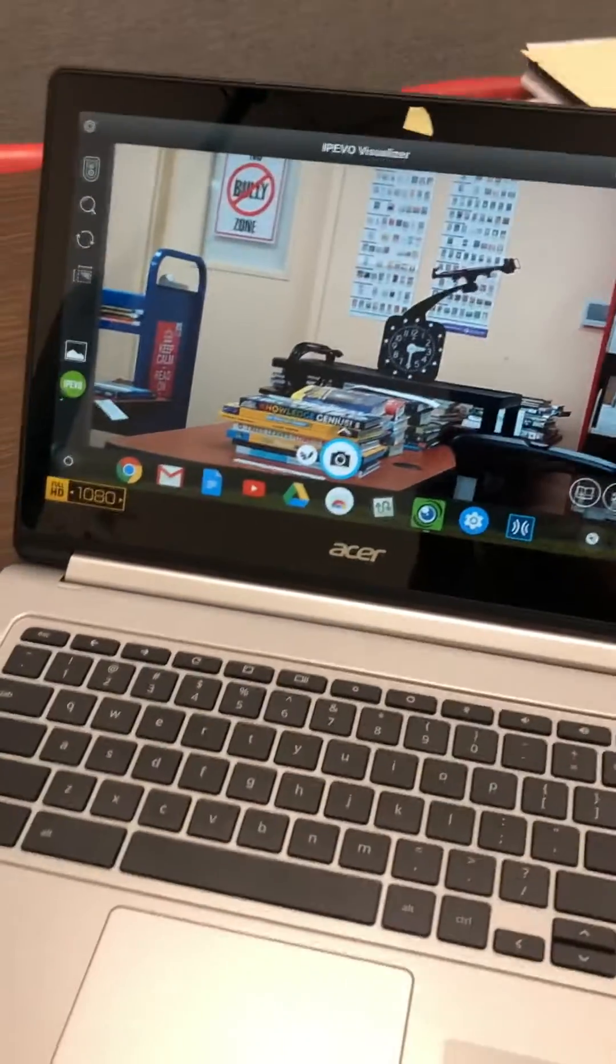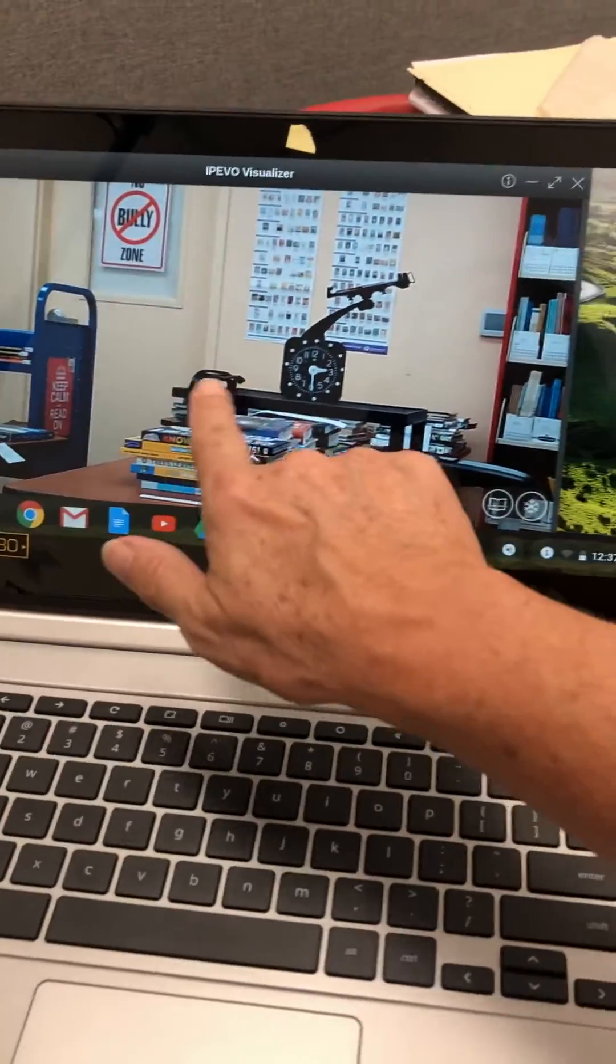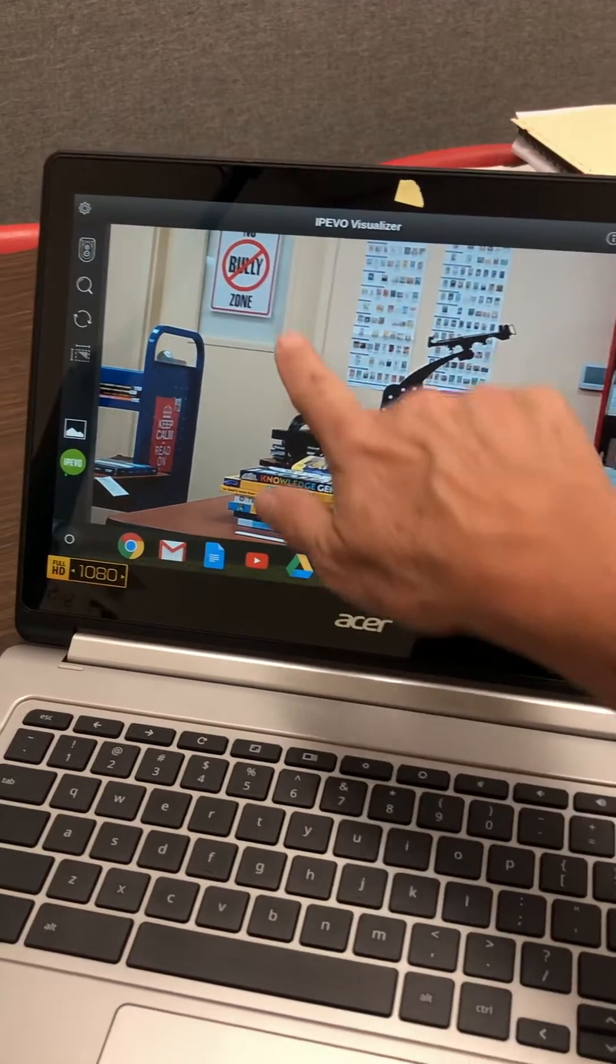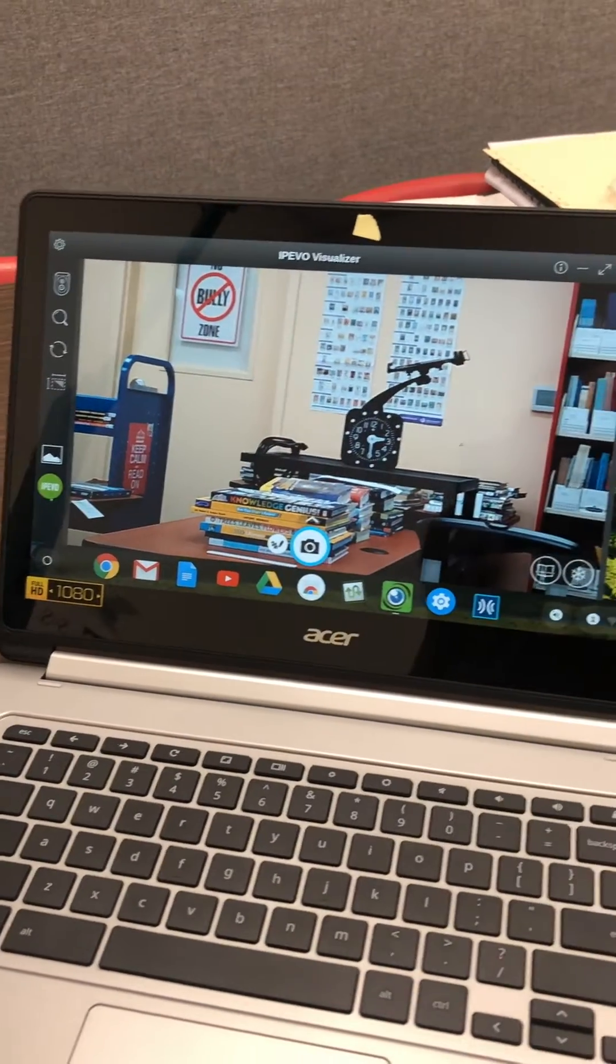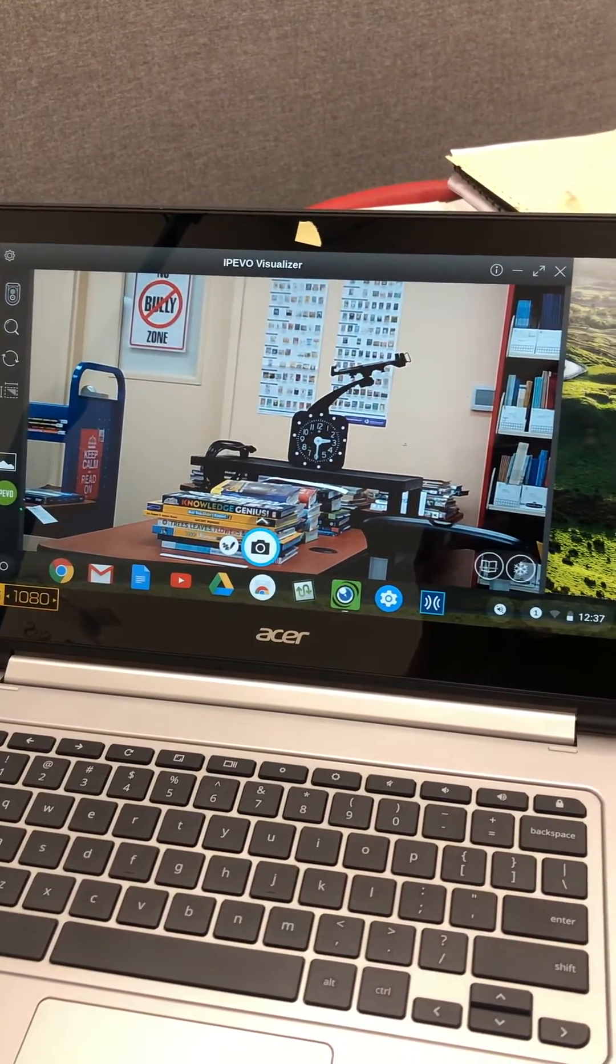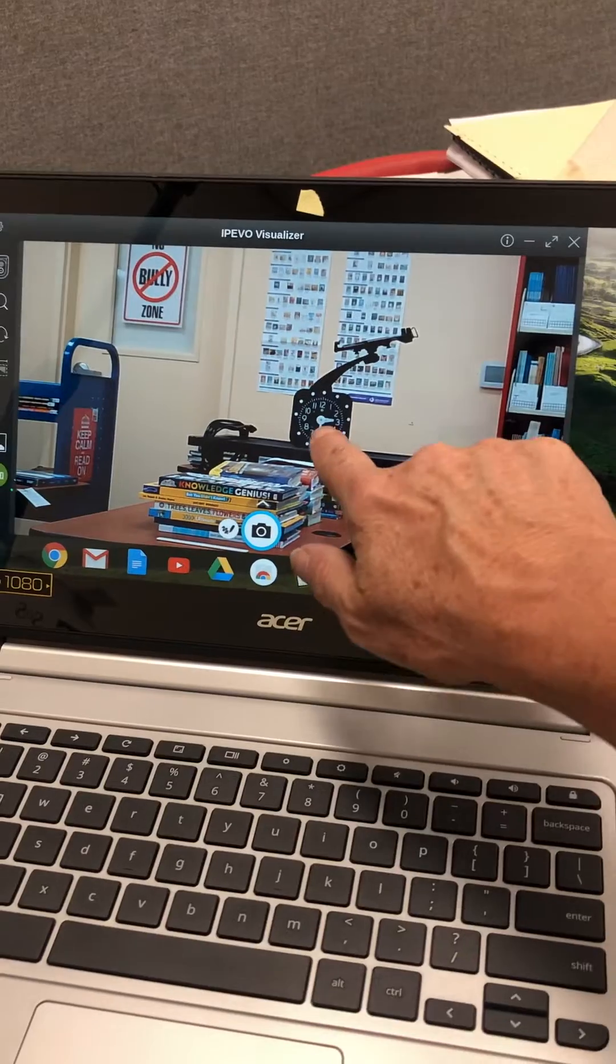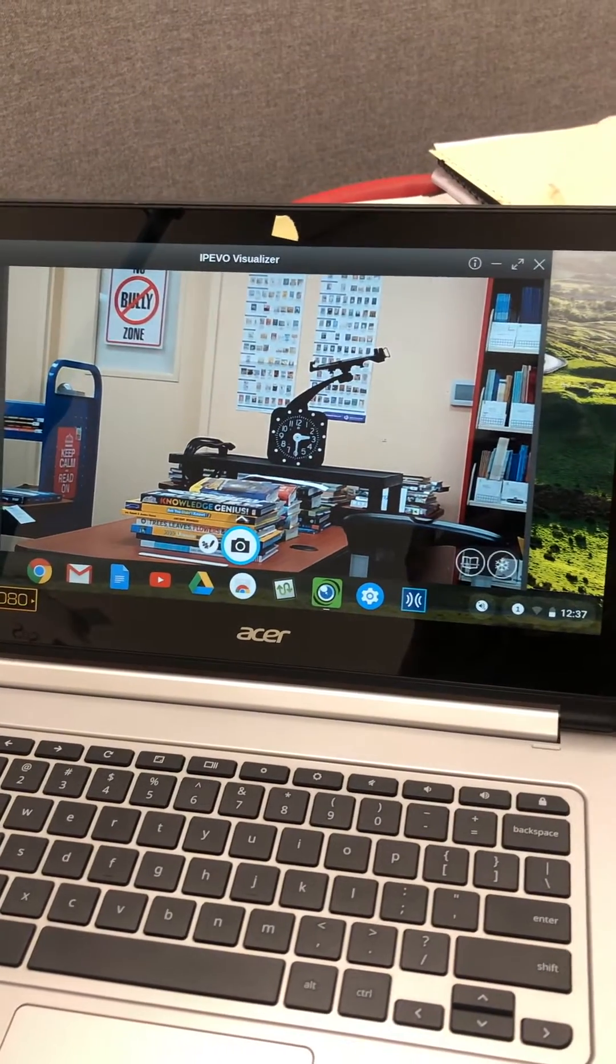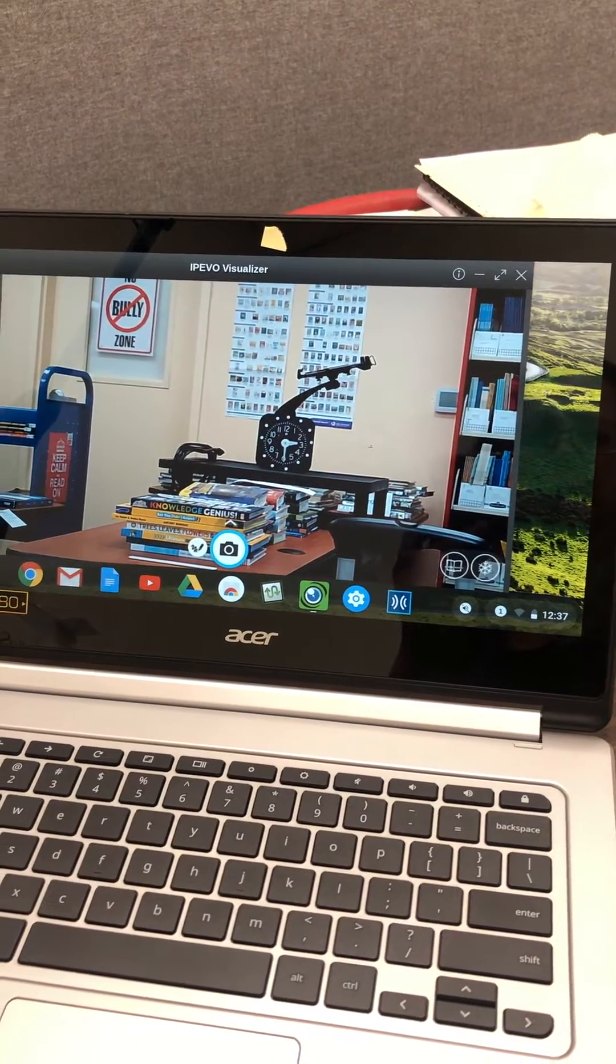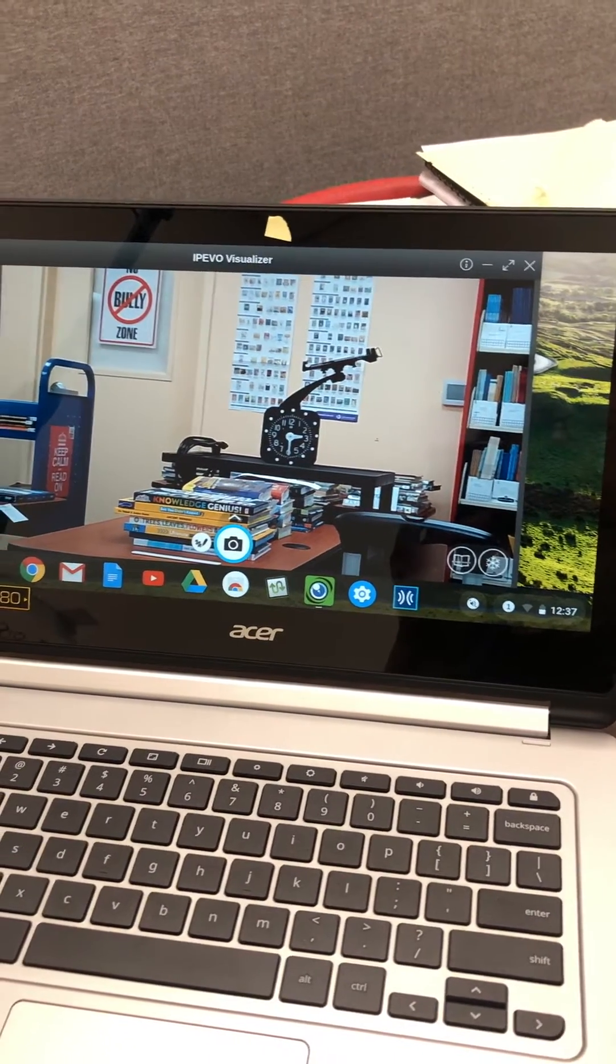And this is the zoomed out view. The sign on the door, no bully zone, is about 20 feet away and those letters are a little over two inches high. And this APH clock is about 12 feet away and those numbers on that clock are about three quarters inch.